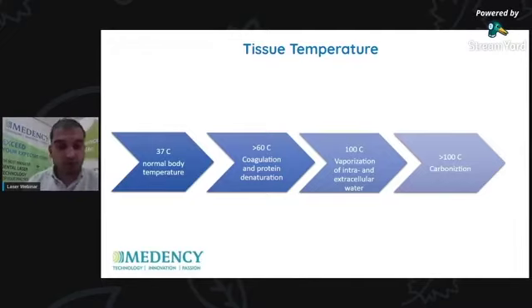Let's go back to our tissue temperature and the photothermal effect. Let's arrange our thoughts. The laser is absorbed in the tissue according to the chromophore, and we have now used the photothermal effect. The photothermal effect means that the laser is absorbed and it is converted into heat. This heat is very useful and can be very bad.